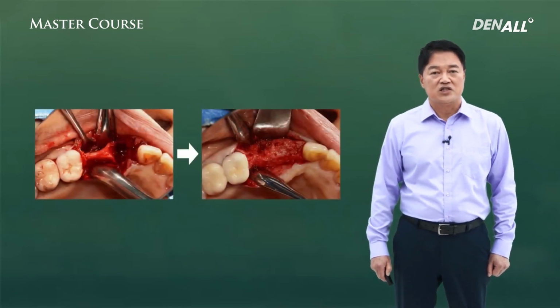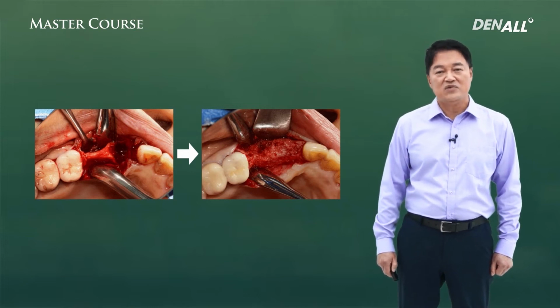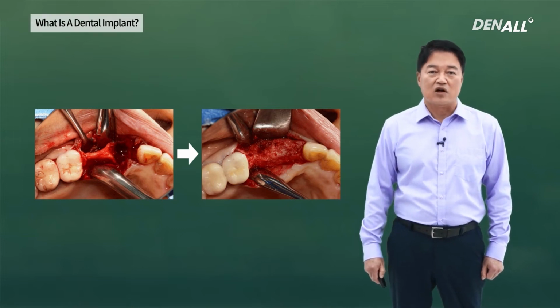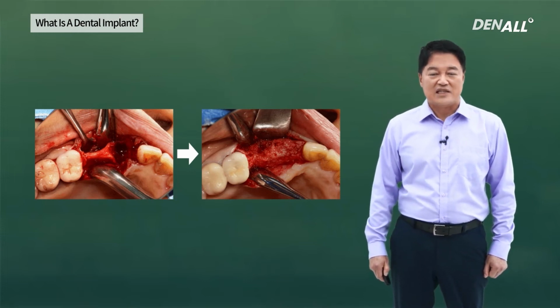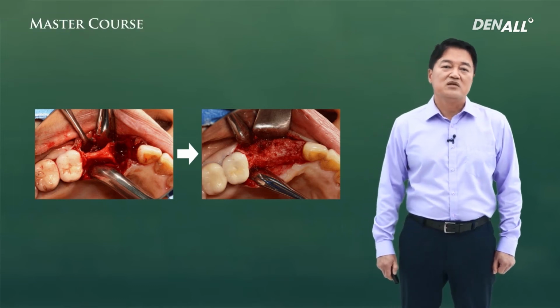If you look at before and after, appropriate GBR and socket preservation was done. Originally, it was a difficult implant case, but the situation has turned favorably. Ways to achieve such a favorable change will be addressed in a GBR sample lecture and advanced course.